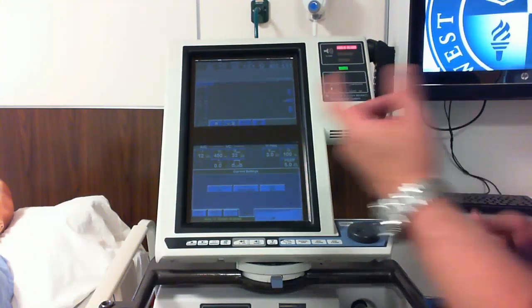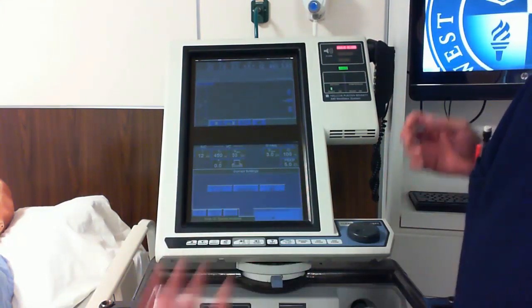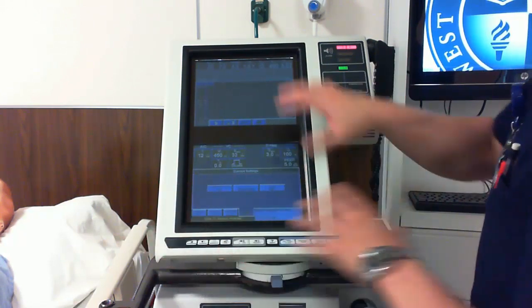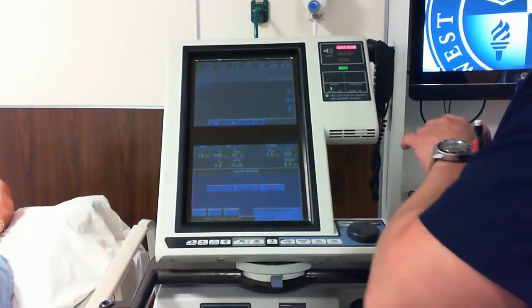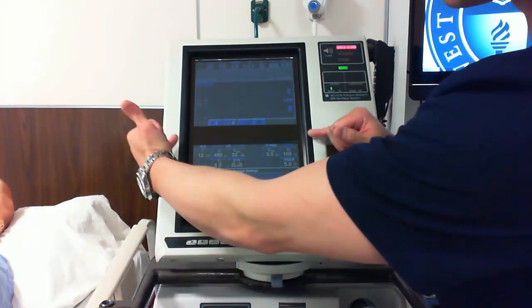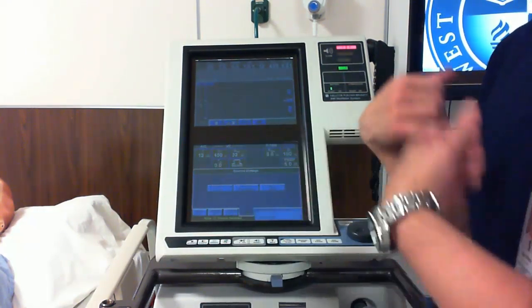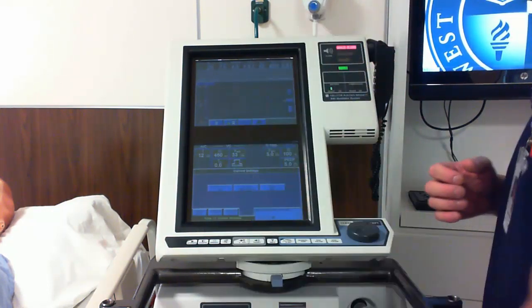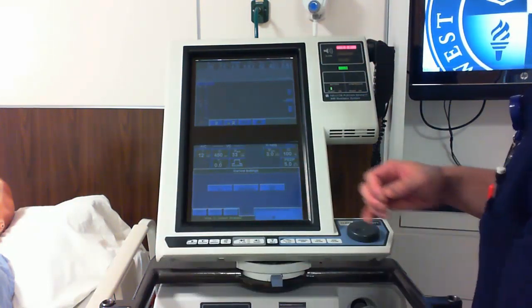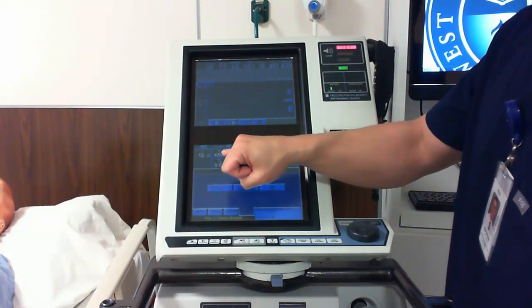Alright, and now we're taking a look at the ventilator. We have our screen here. As a student, as a nurse, we aren't going to be dealing a whole lot here on the screen. We do notice though that on the bottom portion here on this ventilator for this manufacturer, we have a list of settings, being the ventilator mode. This F is standing for frequency, which might be representative of rate on different ventilators as well. Tidal volume, represented by this capital V, subscript capital T.